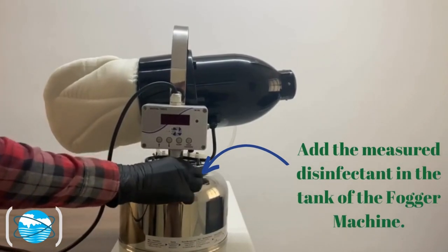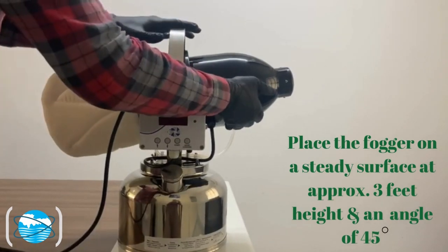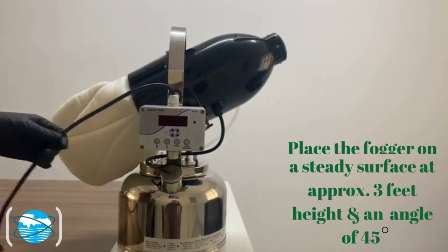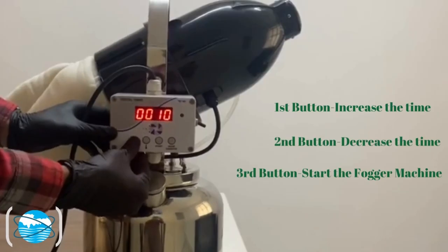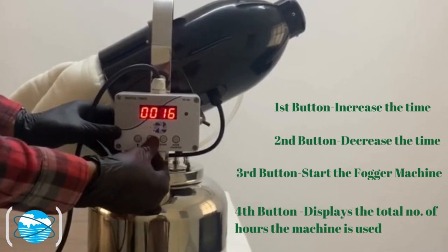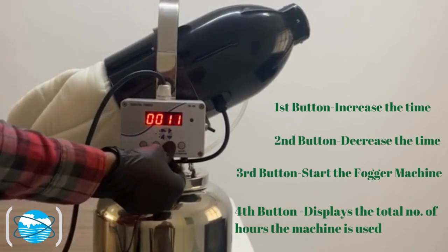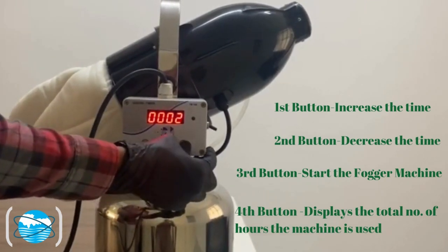Add the measured disinfectant in the tank of the fogger machine. Place the fogger on a steady surface at approximately 3 feet height and an angle of 45 degrees. Make the necessary power connections and switch it on. The first button is to increase the time, the second button is to decrease the time, the third button is to start the fogger machine, and the fourth button is to display the total number of hours the machine is used.